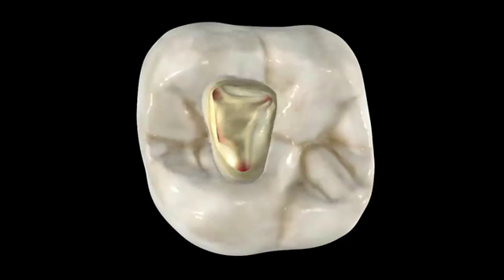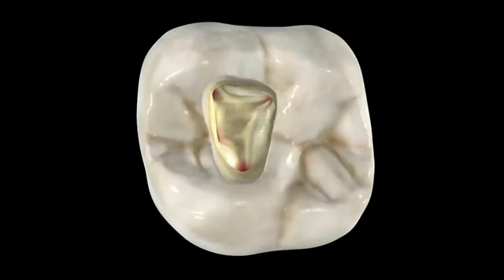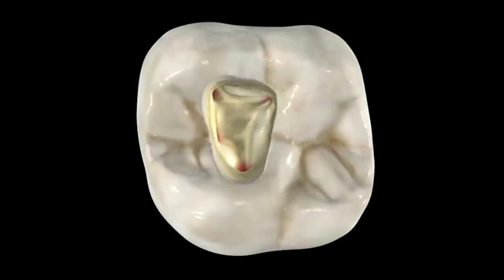The size of the access cavity isn't a school of thought or personal philosophy — it is dictated by the orifices on the pulpal floor. The walls should diverge from the pulpal floor out to the occlusal table. A good indicator for finished access is that the axial walls are flared, flattened, and finished. Now that we're into the tooth safely, we move to our assignment of canal preparation, which all starts with glide path management.